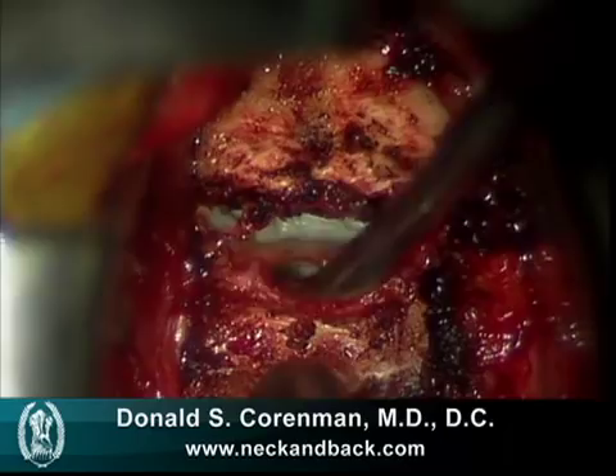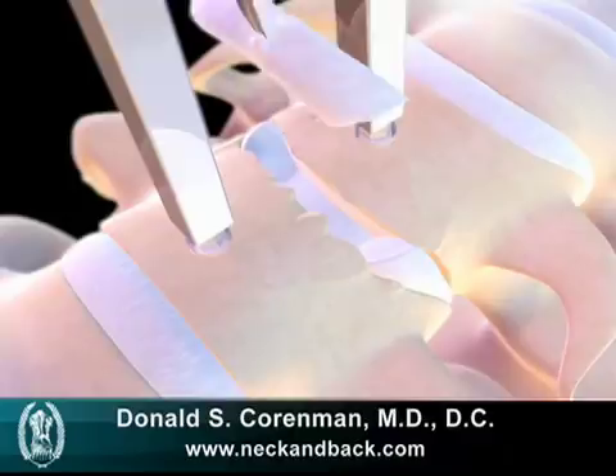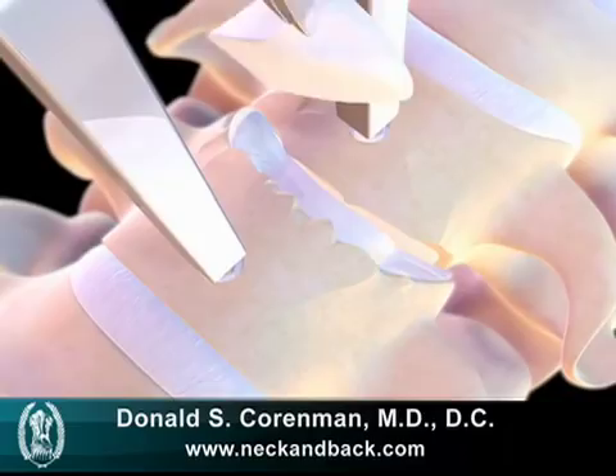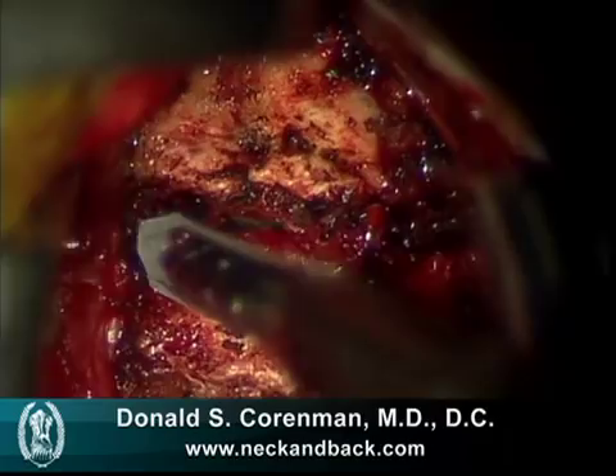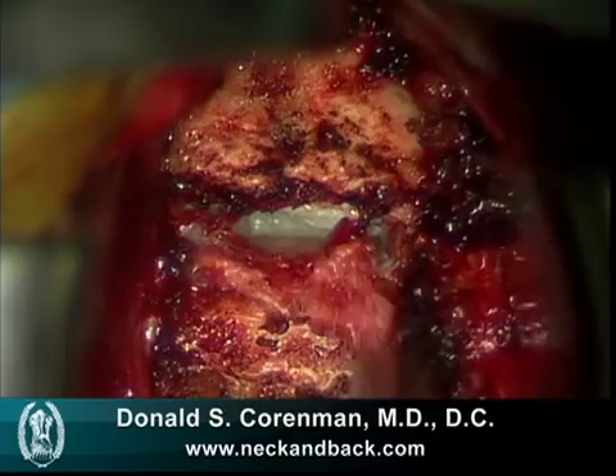We then take off the anterior aspect of the annulus, and this video depicts how it's done in a simple manner. We'll see how we do it using a typical 11 blade — here's the little tiny scalpel that goes in and removes this annulus. The nucleus is missing in this patient; it had actually dissolved away, and the rest of it went to the back of the neck, compressing the nerves. Here we see a small tool removing this portion of the annulus.